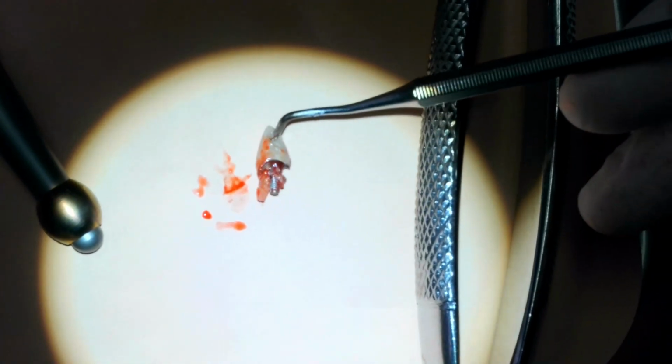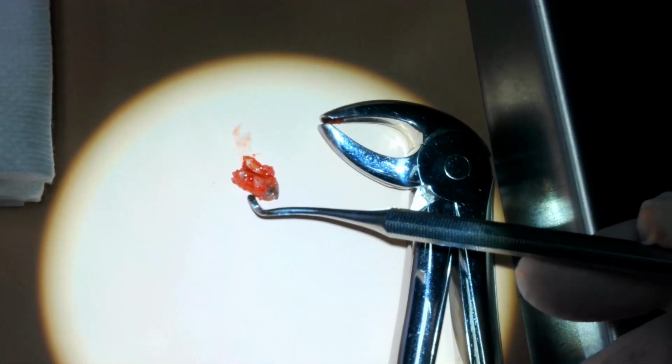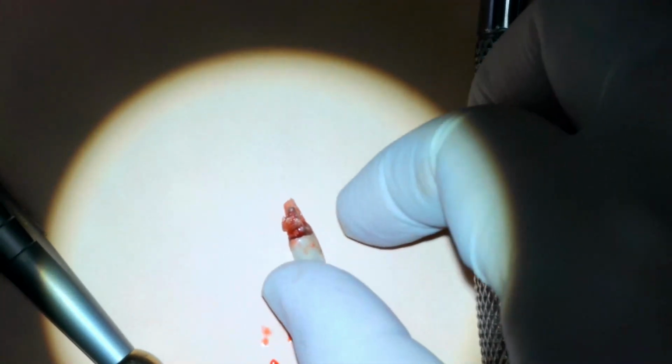And then here's just a close-up of the crown and post, and then there's the bottom part of the root with some granulation tissue still attached to it. Let me just fit those together, and you can see how it's split quite a ways down, almost to the root tip.